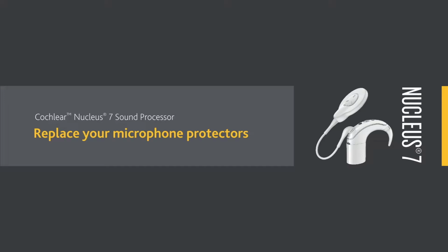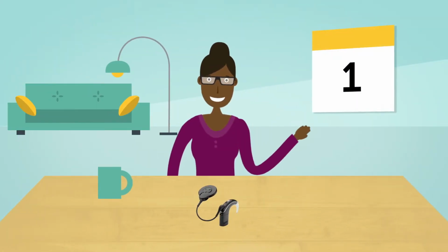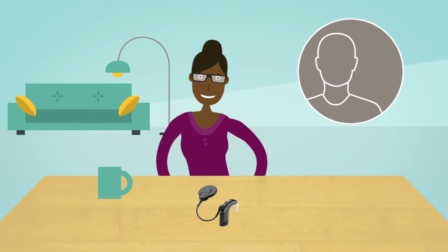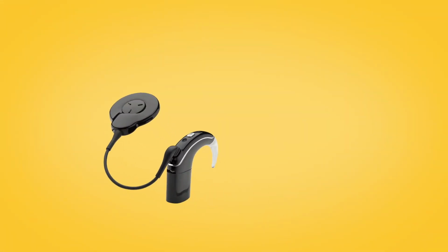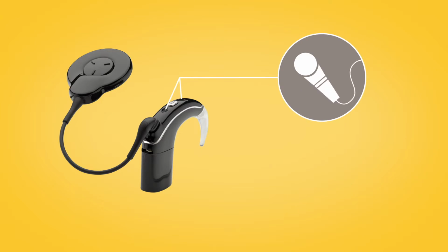You should replace your Cochlear Nucleus 7 sound processor's microphone protectors every 3 months, or sooner if you live in a high humidity environment, perspire frequently, or notice degradation in sound quality. It is important that you keep your microphone protectors in place at all times. Microphone protectors are built into the Nucleus 7 microphone cover, which is completely replaced.